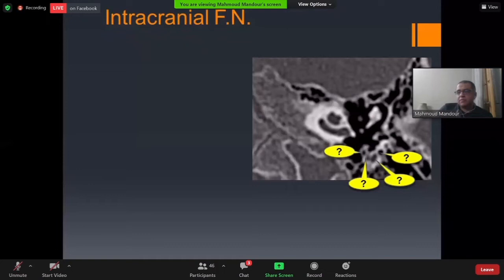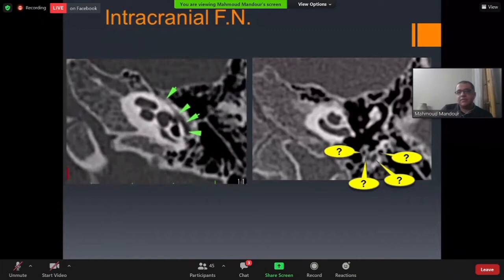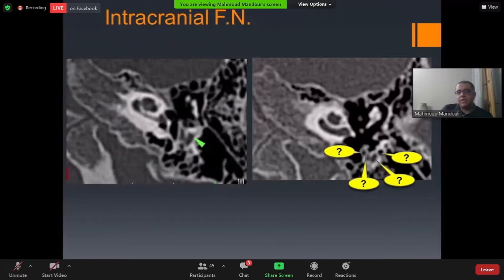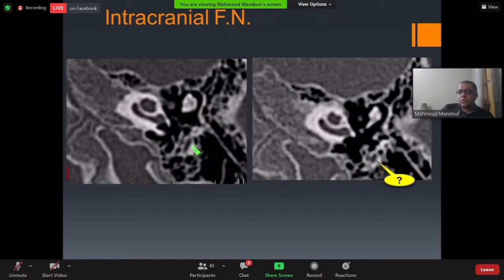To solve this problem, serial tracing is essential. By tracing the labyrinthine segment, then the tympanic segment, then following downward, we can localize the mastoid part of the facial nerve. Without serially tracing from superior to inferior using radiological software, it may be difficult in some cases to actually locate the mastoid segment.